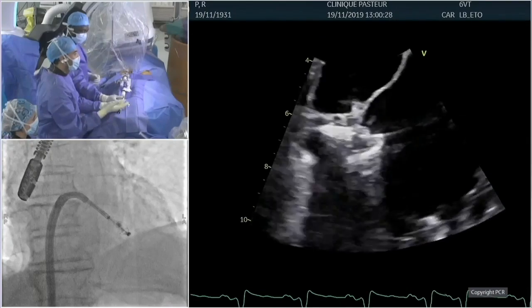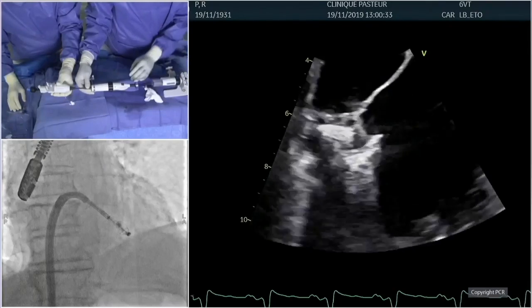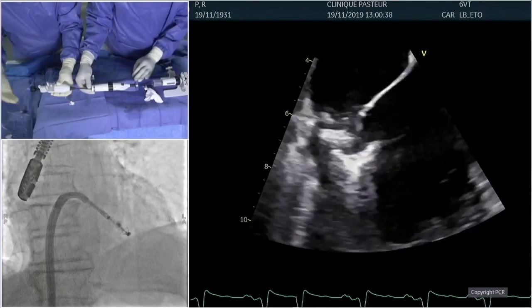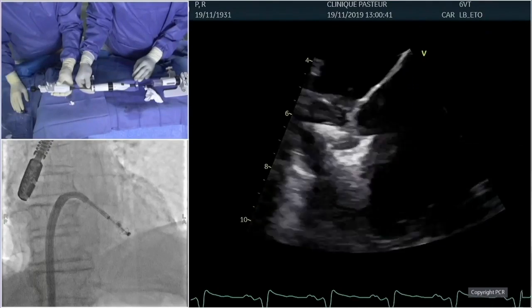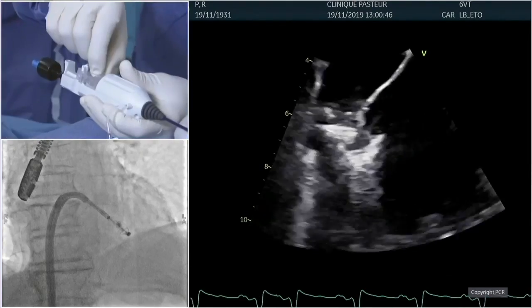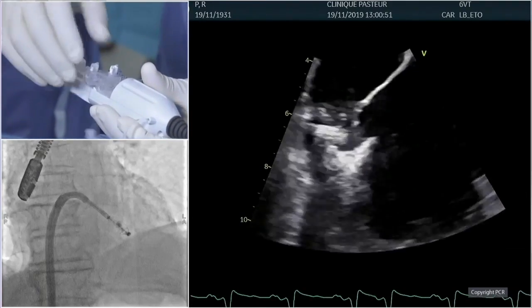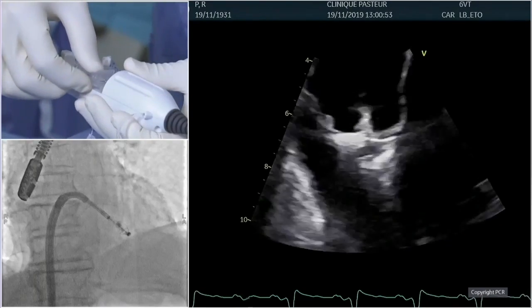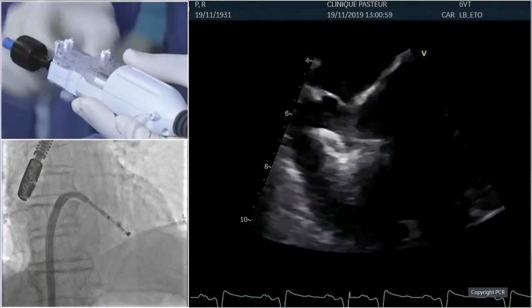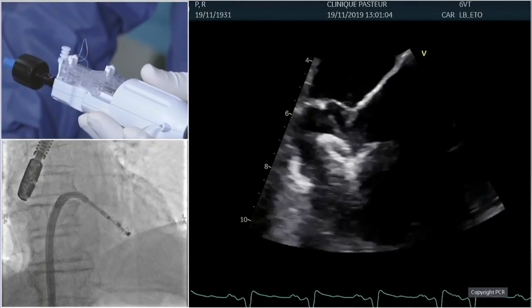So we have two options. Either we remove the two clasps and go for another attempt, or we can try a differential. So what I'm going to do, if you see my handle, is remove the slider pin here and go up with a posterior clasp. And I'm going to correct a little bit more posterior. You see, advancing a little bit more posterior.